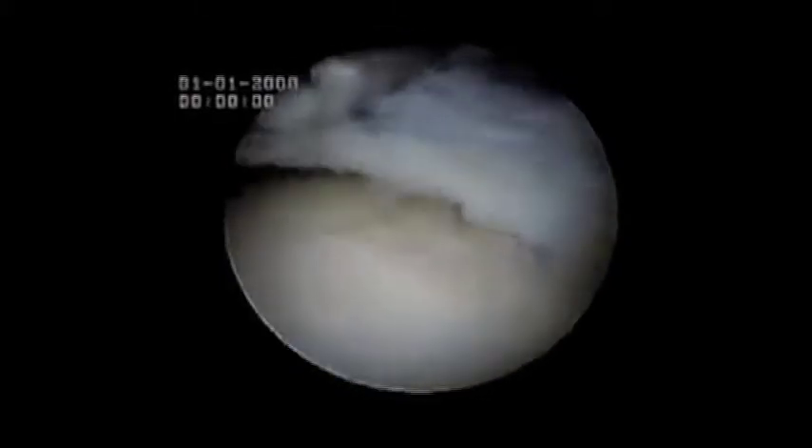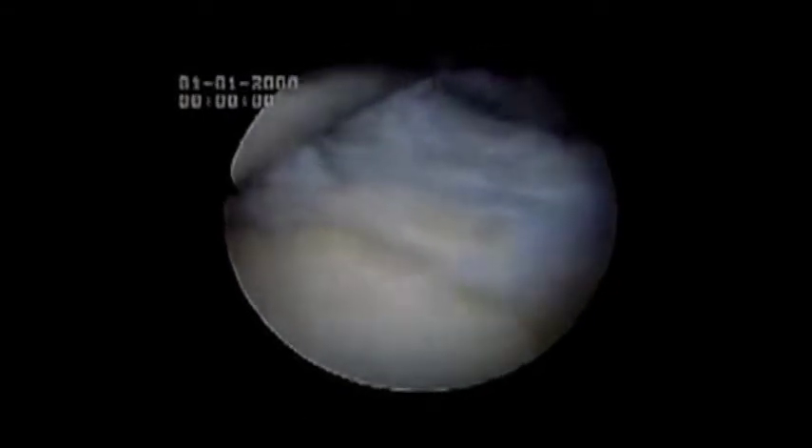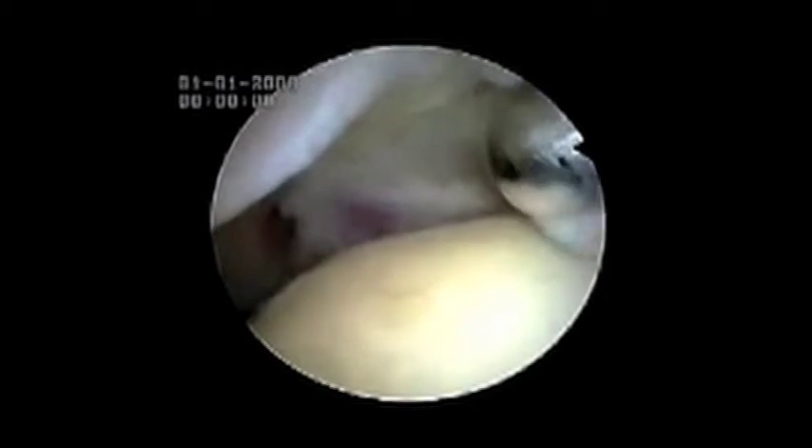Meniscoid bands are one of the causes of lateral gutter impingement syndrome and cause a painful snapping or clicking sensation. Here you can see the dense nature of this meniscoid band, named because of its appearance and similar texture to a torn meniscus in the knee.